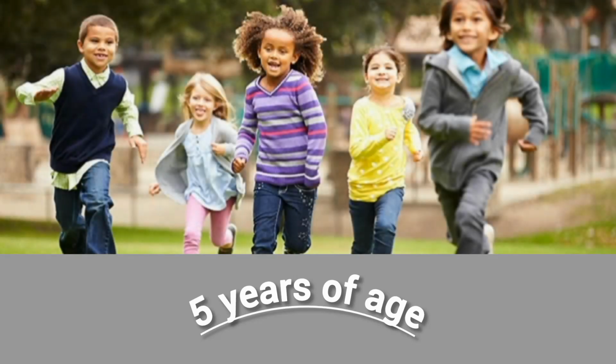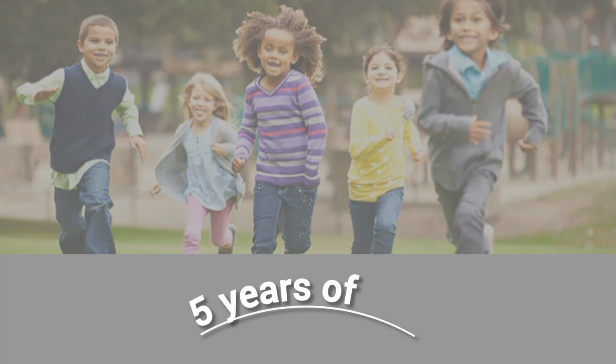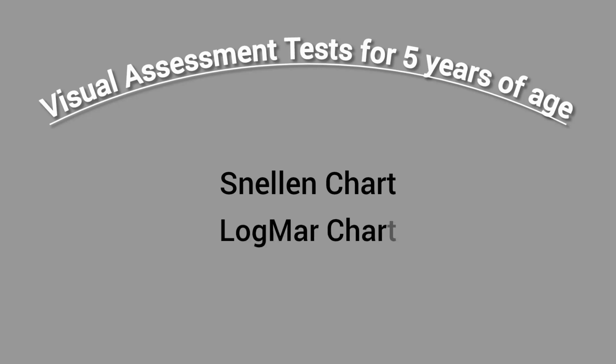So the last age group is 5 years of age. Now the child has the ability to read the letters, right? He is a grown up child, so he can respond to what you have asked. In that case you can simply perform the Snellen acuity chart and the Logmar acuity chart. Snellen and Logmar charts are the commonly used test charts for the assessment of visual acuity in older patients, in younger patients and in adults as well, right?